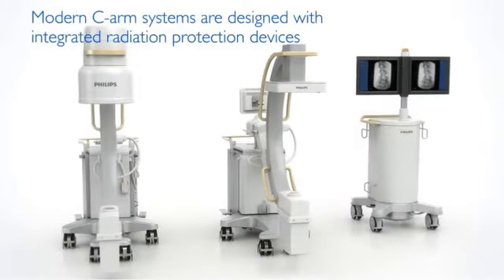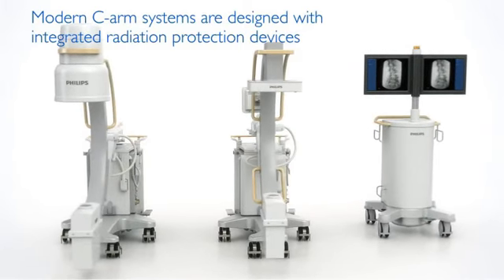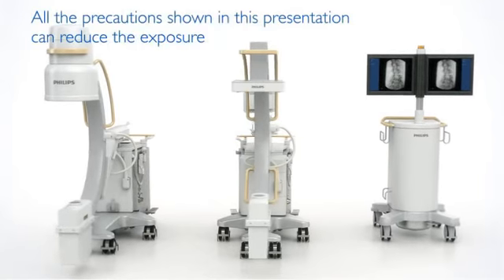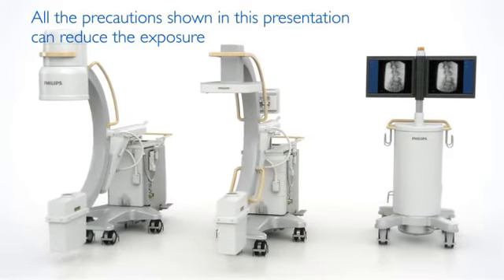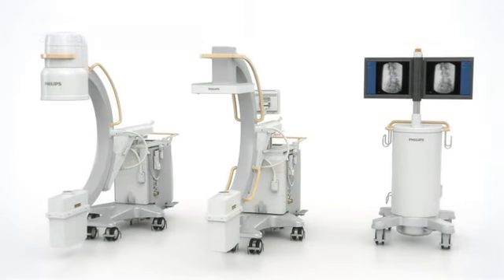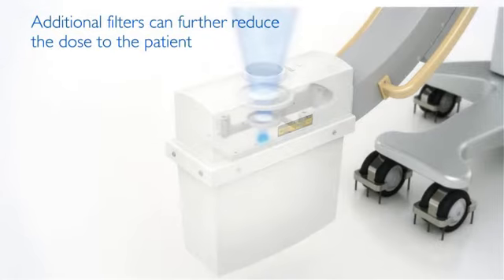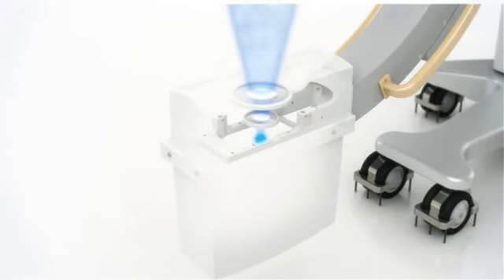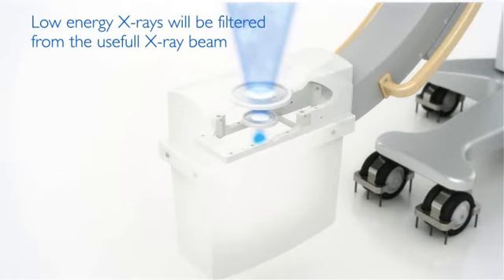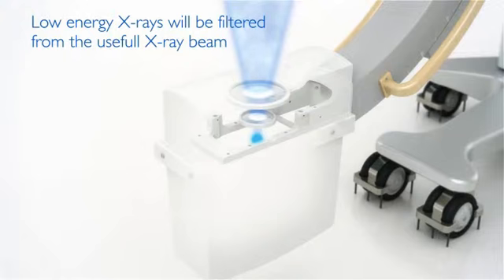Modern C-arm systems have also been designed with integrated radiation protection devices. All the precautions shown in this presentation reduce the radiation exposure received by patients and staff. The radiation dose for the patient is further reduced with the use of additional filters. X-rays with lower energy, which do not contribute to the image, can be filtered from the useful X-ray beam.